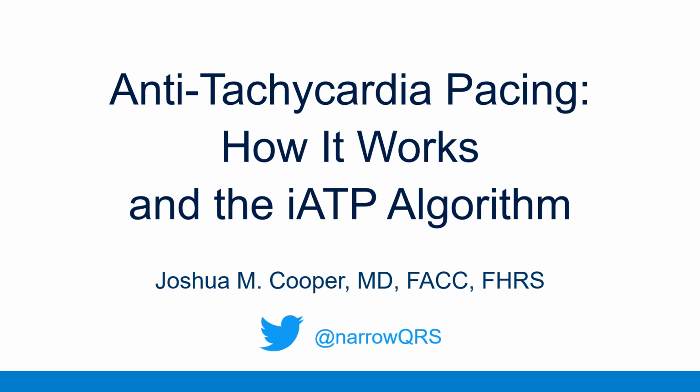This is Dr. Joshua Cooper, and this video is about anti-tachycardia pacing. We're going to discuss reentrant ventricular tachycardia and how pacing can be used to painlessly terminate reentry without resorting to painful ICD shocks. This video is nicely complementary to the one on entrainment pacing.